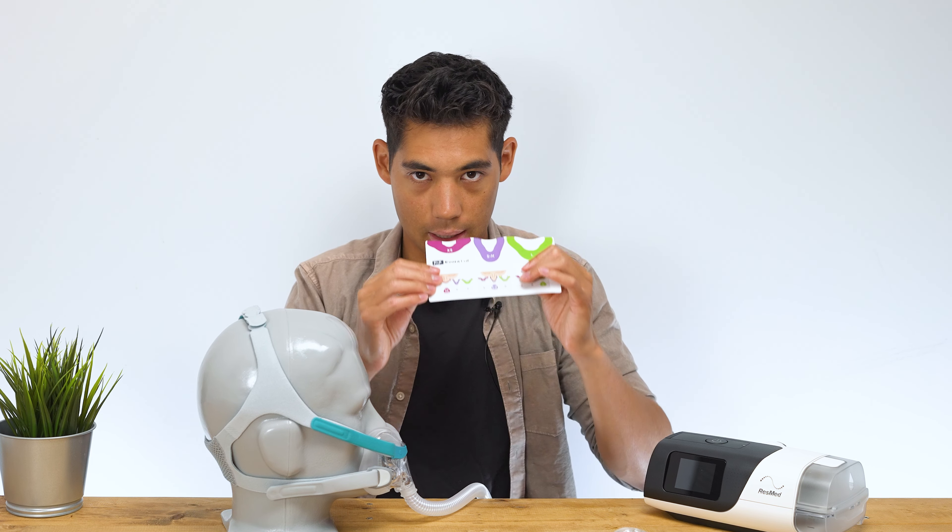That said, if you're tossing and turning at night with the tube at the front of your face, there's going to be more tube drag — it can wrap around your arm because every time you turn it gets in the way. Whereas when the tube and elbow are at the top of the head on a swivel, turning your head doesn't get in the way. So consider when buying: are you more bothered by tube drag or by hearing air rush past your ear?